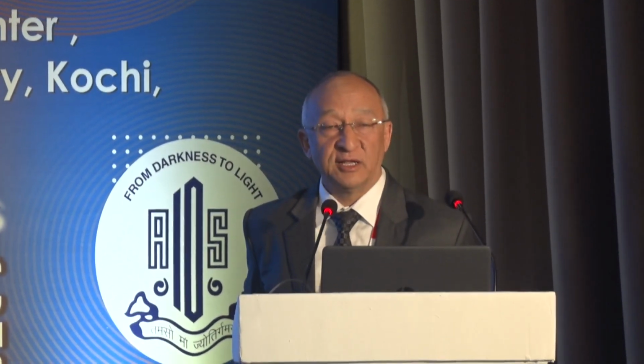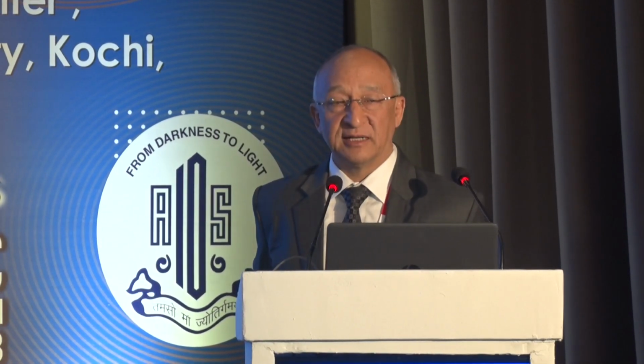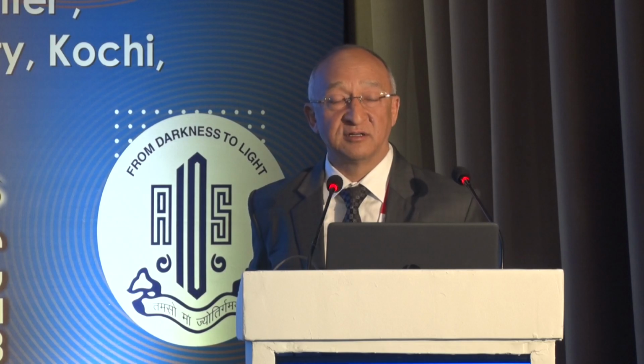Yeah, that's a good question. We see patients on the first post-op day for all patients, so I do analysis for every patient on day one. First we do an undilated refractive analysis and visual acuity for distance, near and intermediate. Then I do a little dilatation for these patients. At least a 5 millimeter dilatation is required for a good analysis. That's the cutoff. Then I do EyeTrace for all my premium IOL patients.